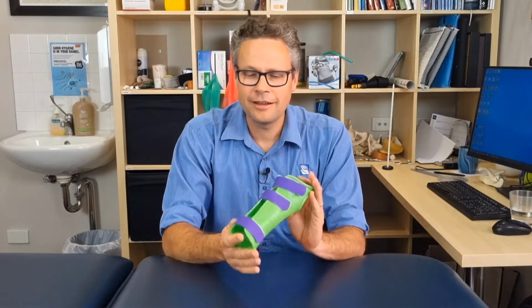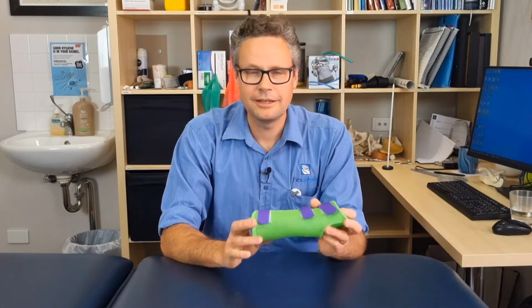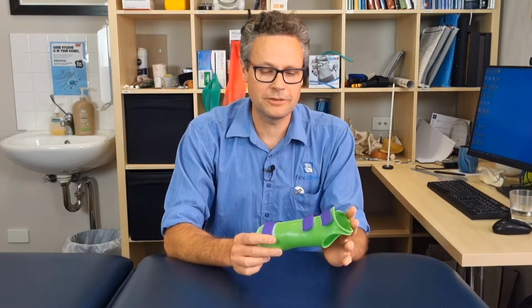Here's a great question. Why do I like thermoplastic splints so much? They are incredibly light, yet tough and durable. They are individually molded, so they tend to fit well, but they're also very adjustable. If they're uncomfortable, they can be remolded as much as necessary. They're completely waterproof, which makes them washable.